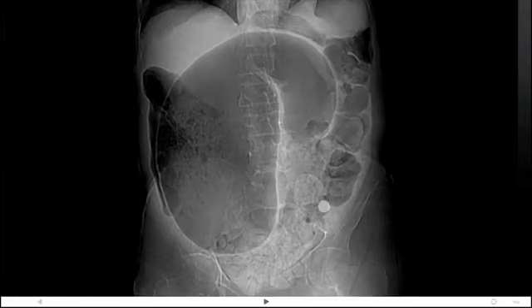Another cause of abnormal intraluminal gas pattern can be the presence of a volvulus. Patients presenting with a volvulus may present with symptoms similar to that of obstruction. A volvulus can commonly occur idiopathically in older patients and is due to the twisting of the bowel upon its mesentery.